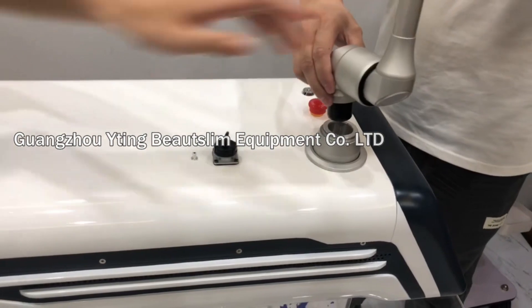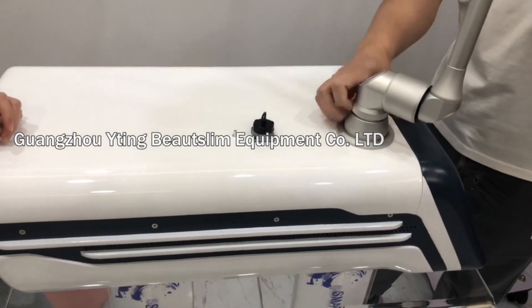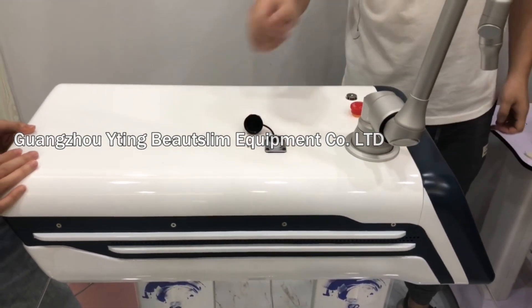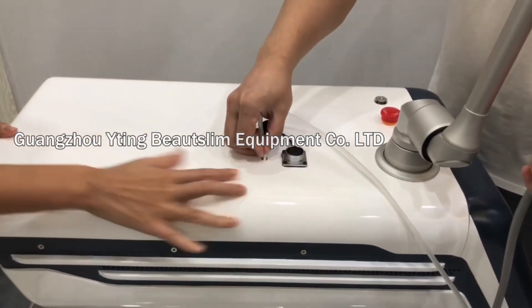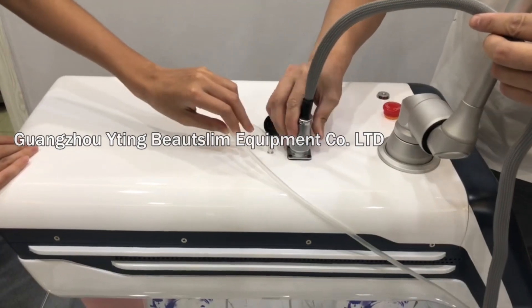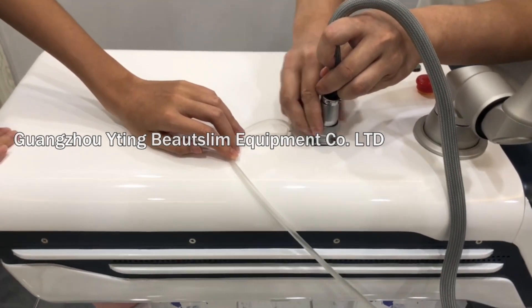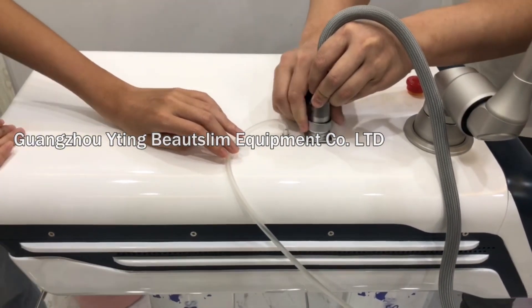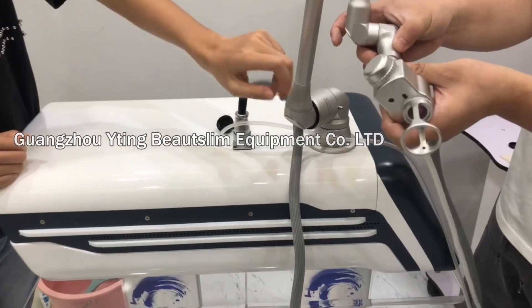Firstly, connect this light guide arm and connect this tube here. Then connect the working head here.